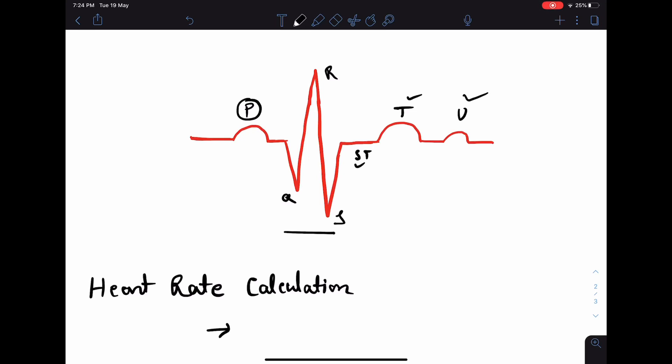There are also two intervals in ECG. One is PR interval, one is QT interval. PR interval starts from the beginning of the P wave up to the beginning of QRS complex. And QT interval starts from the beginning of the Q wave up to the end of T wave. And ST segment is the segment between the end of the S wave up to the beginning of the T wave.